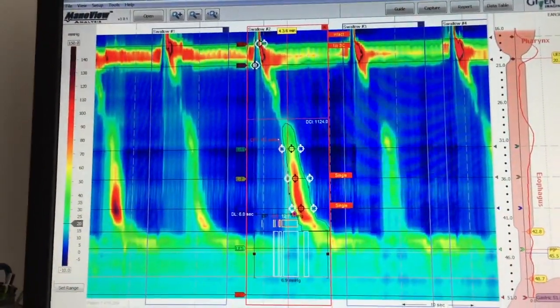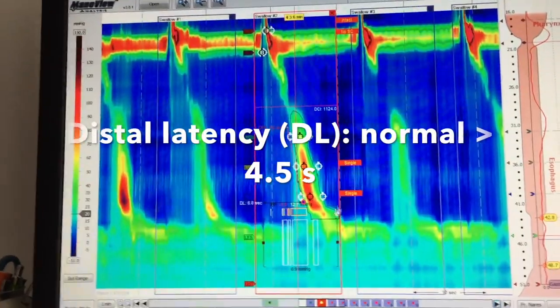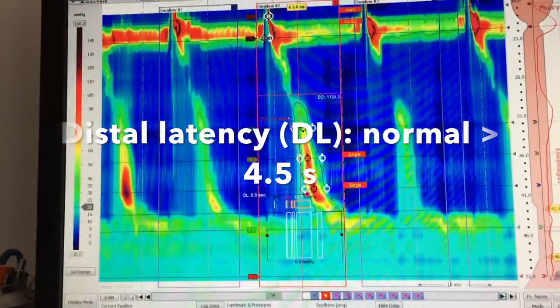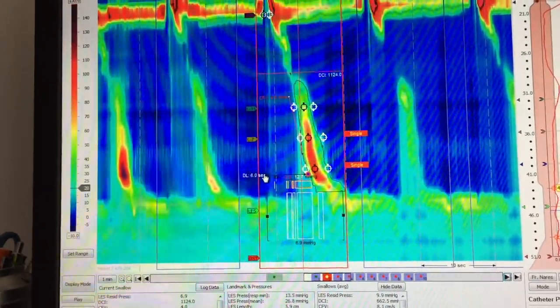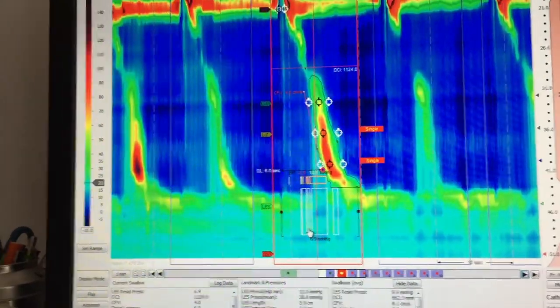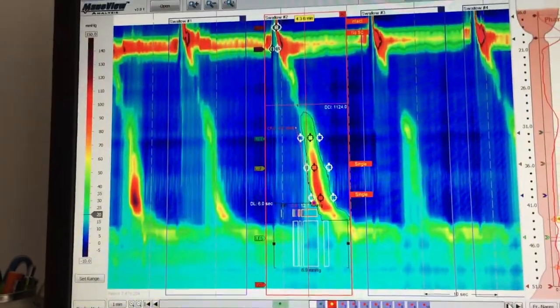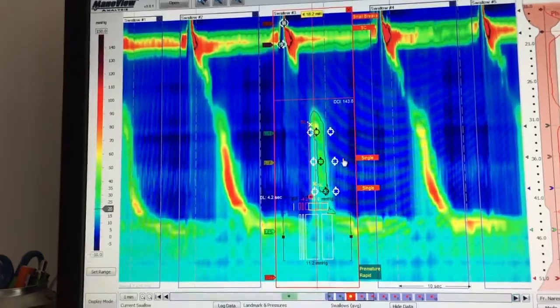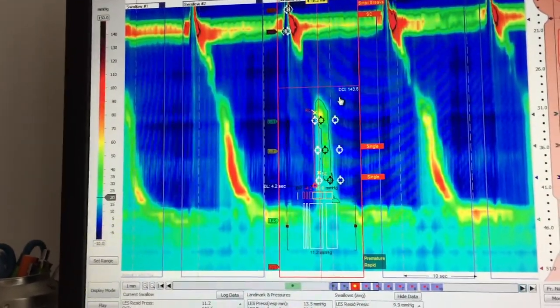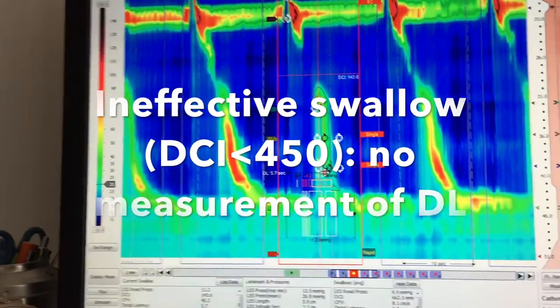I will go to the next one. Normal DCI, normal distal latency. The distal latency is measured between the opening of the upper esophageal sphincter and the CDP, which is here. The distal latency is normal, as well as the IRP — so we have a normal swallow. I move to the next one. Here the DCI is low, so we have an ineffective swallow. In the case of an ineffective swallow, we do not measure the distal latency.